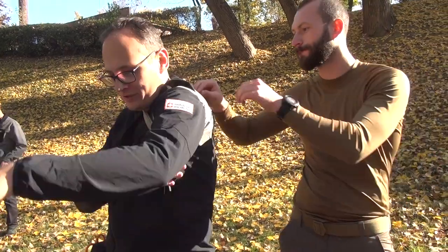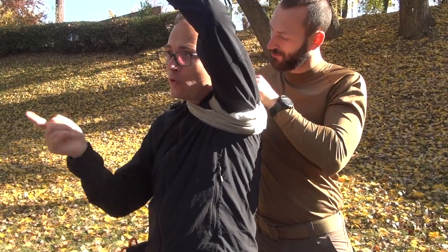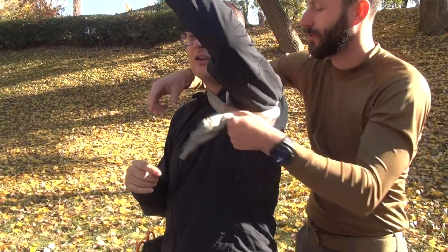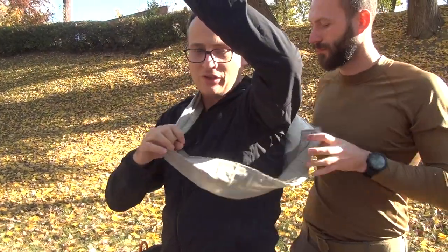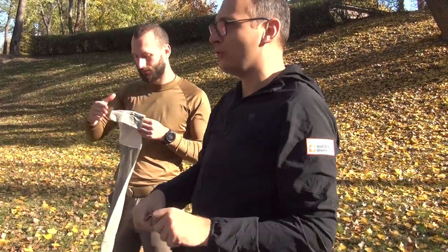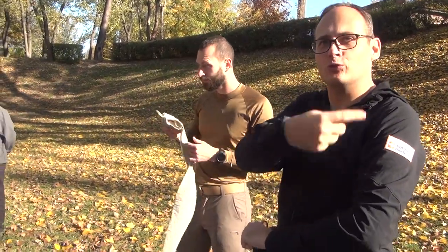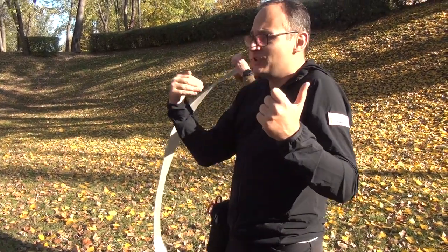So this is as a bandage, but when it's a hemostatic gauze, the old-fashioned ones were rolled in a roll. But the hemostatic gauze, you should never wrap around. You have to put it inside the wound. Most new hemostatic gauze are folded like wafers, so you don't get tempted to wrap it around a wound, because if you wrap it around, it doesn't work. It really needs to go inside the wound and get in touch with the blood, so the clotting agent closes it off. Okay, so we've packed the wounds.